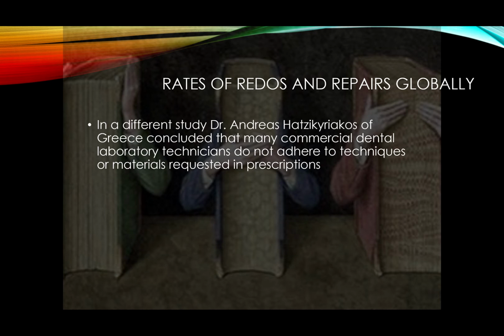I don't know what is it with dental technicians, and I am a dental technician. I'm a master dental technician, actually. And I've been practicing for more than 15 years, as I established in the first video, but it's weird. It's like they do not want to stick to what's written in the prescription pad. Like A2, oh no, nothing is A2, let's make it A2 in the middle third, but incisally we'll make it A1, and then cervically we'll make it A3.5. But why would you do so?